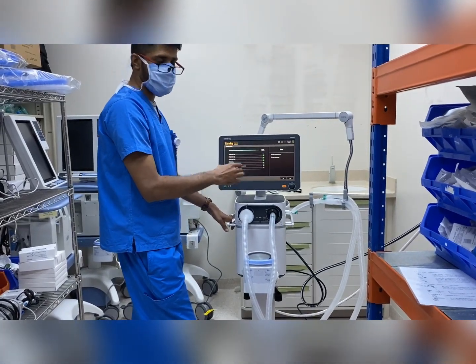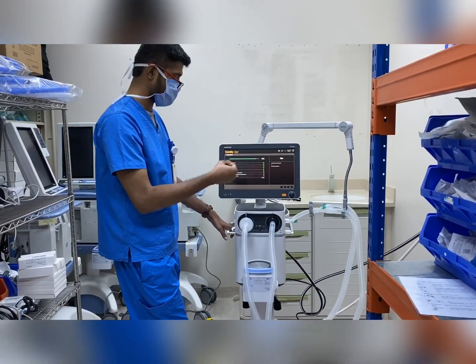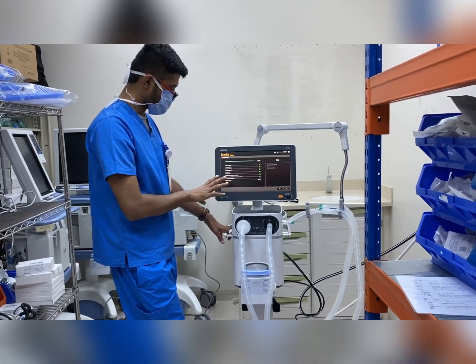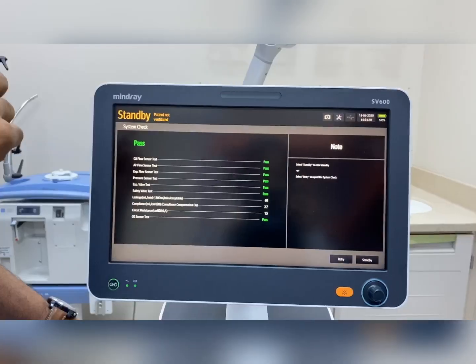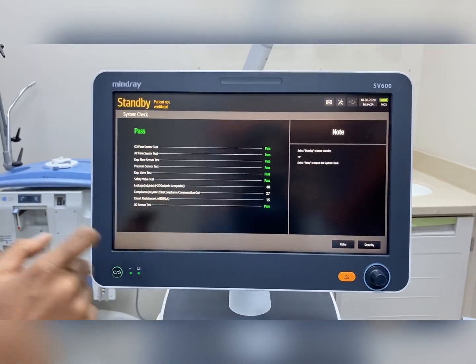The initial calibration will complete within 40 seconds, and only the oxygen sensor calibration will take at least 60 seconds. The calibration is now complete and you can see all the values have passed for the machine.